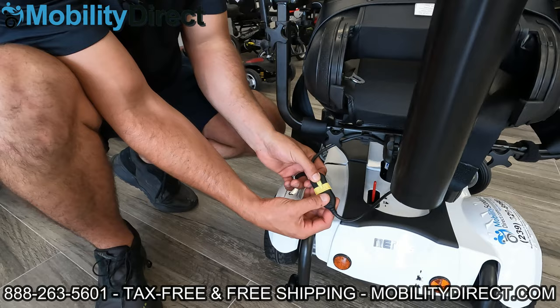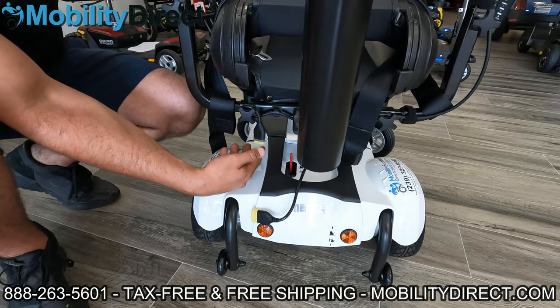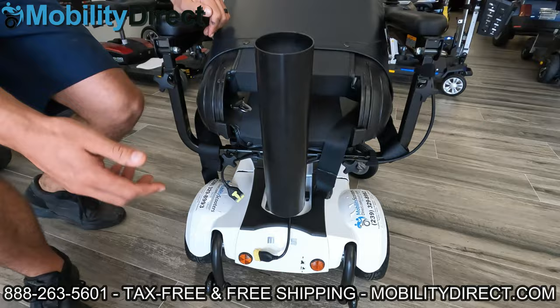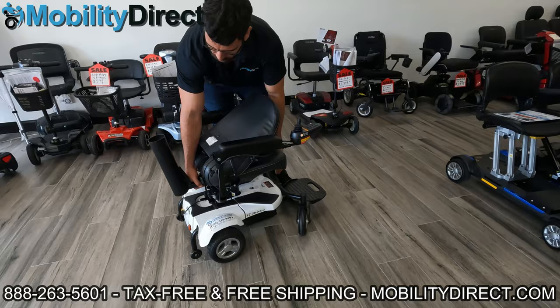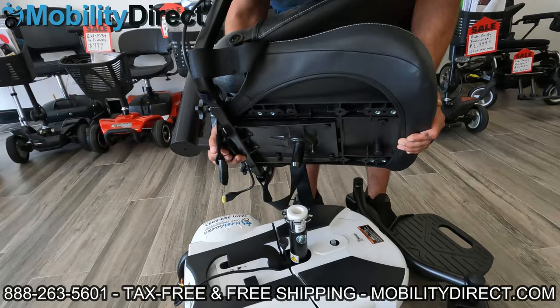Here you just push up on this, detach that, and now the cable running to the joystick controller is free, so I can remove the seat without pulling on and potentially ripping apart this connector. For this particular model, all you have to do is reach down, get a firm grip on the bottom — on the front and the back — and pick straight up just like the other models. As you can see, there's a male connector and a female connector for the post assembly, and that is all there is to it.